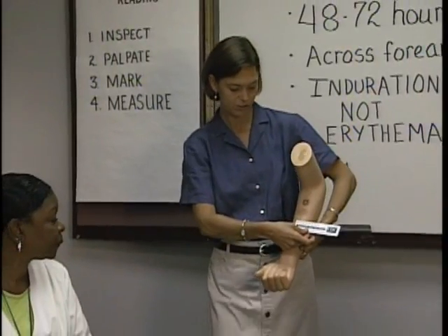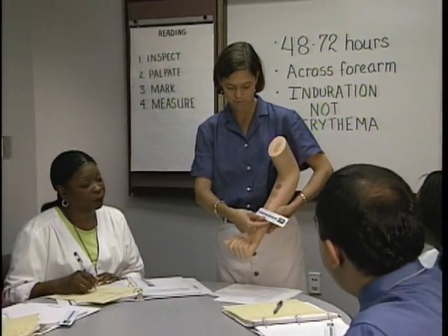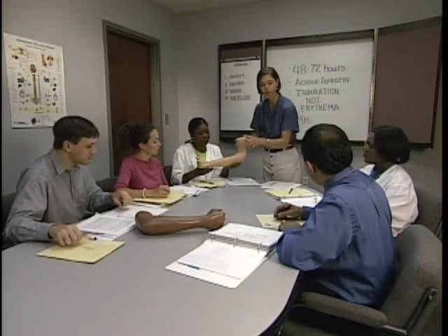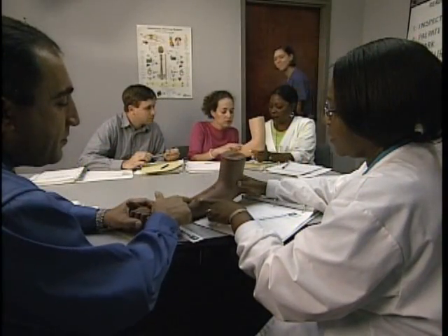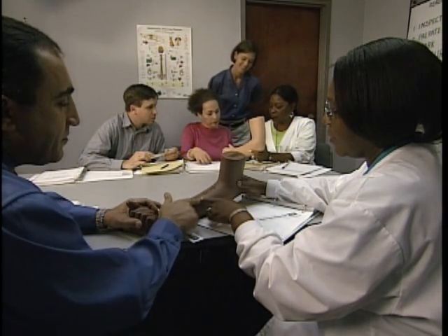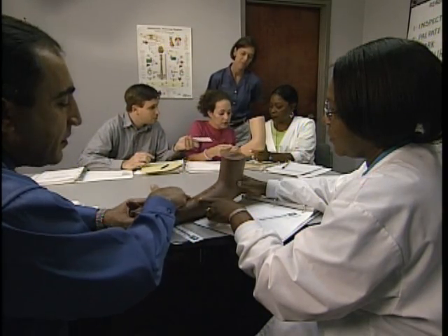There are several different methods for reading the Mantoux tuberculin skin test, and they can vary among facilities. For each facility, everyone reading the skin test should receive training in and use the same method. A great deal of practice is required to achieve consistently reliable measurements.